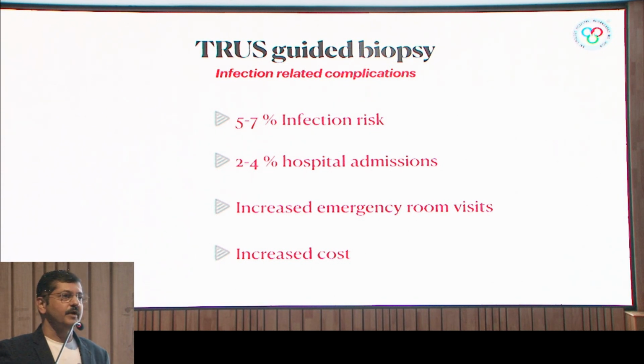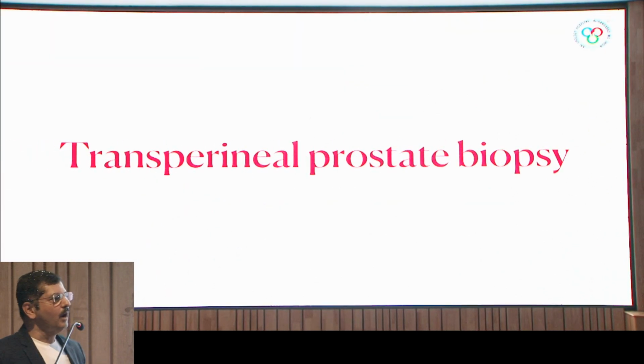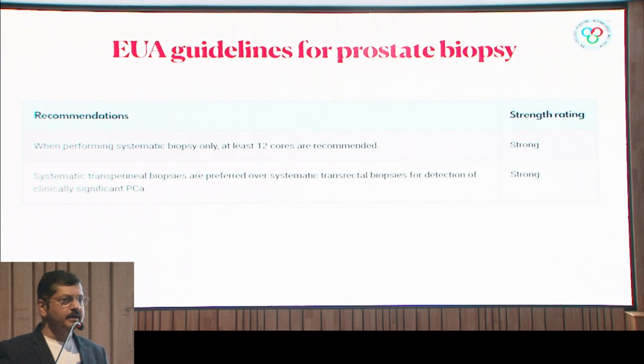And because of this, friends, now we are talking on transrectal-guided prostate biopsy, but soon, or I would say this is an outdated procedure. We should not do transrectal prostate biopsy. We should stop it as early as possible, and what we should now focus on is transperineal prostate biopsy. This is the future, and I am not saying it.